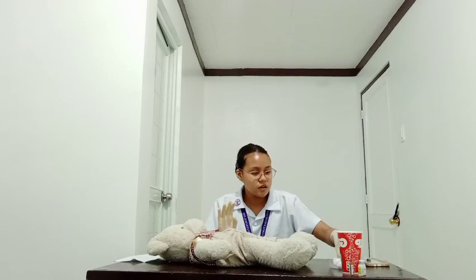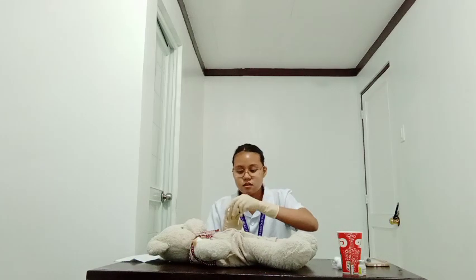And throw in the bin. Now, place and hold the swab between the third and fourth fingers of the non-dominant hand, or position the swab on the client's skin above the intended site. Friction aids in the cleaning of the skin and removes dirt in an outward direction. So again, the third and fourth fingers, right here, of my non-dominant hand, since it is my left hand.